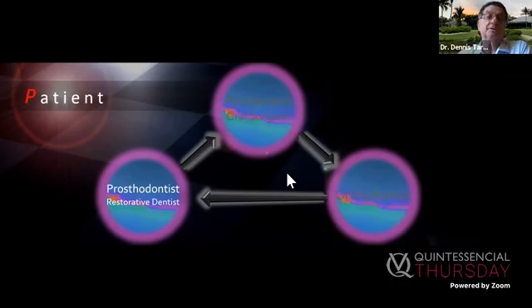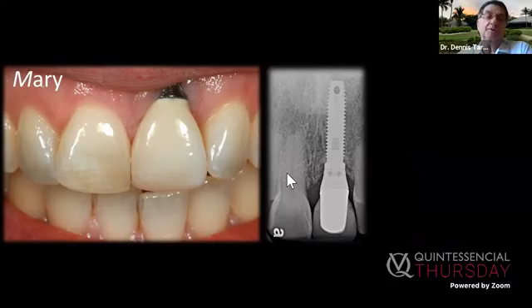First, the restorative dentist. I love Mary's case. Mary's case shows you what a restorative dentist can do, someone who understands wound healing and understands crown contour. Now, Arnie Weisgold in the 70s, at University of Pennsylvania, talked about under-contouring restorations. Flatten the contour, tissue moves coronally. Over-contour, tissue moves up. We all know that, and that's why you saw, even in Arn's cases, some of the cases were too far forward. And that's what you're going to see is the main problem that we always see on the mid-facials.